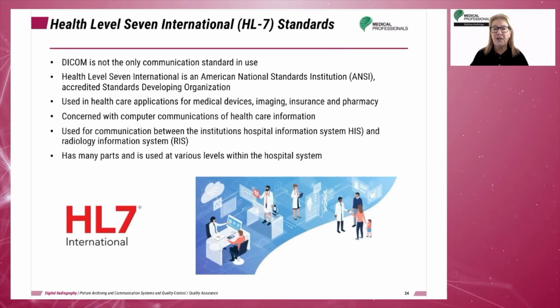HL7 standards govern the communication of most clinical and administrative data, such as patient demographics, reports, insurance claims, and physicians' orders, according to Carter and Veal. The RIS can either pull patient information through a DICOM interface or through a gateway that creates an interface with the HL7 device and the DICOM device.